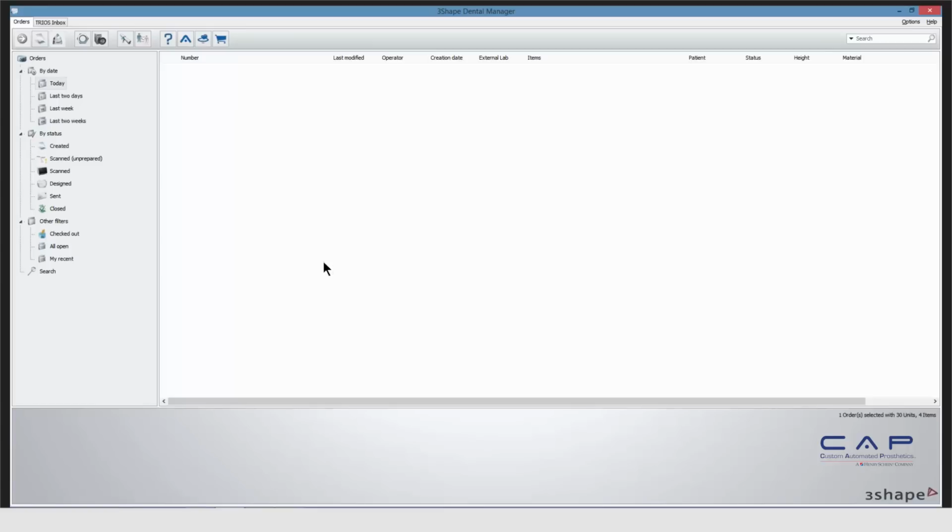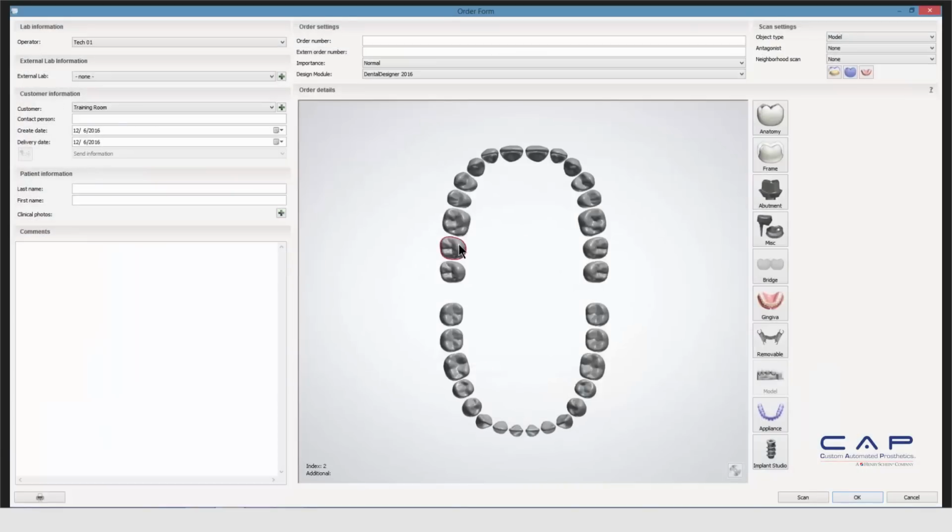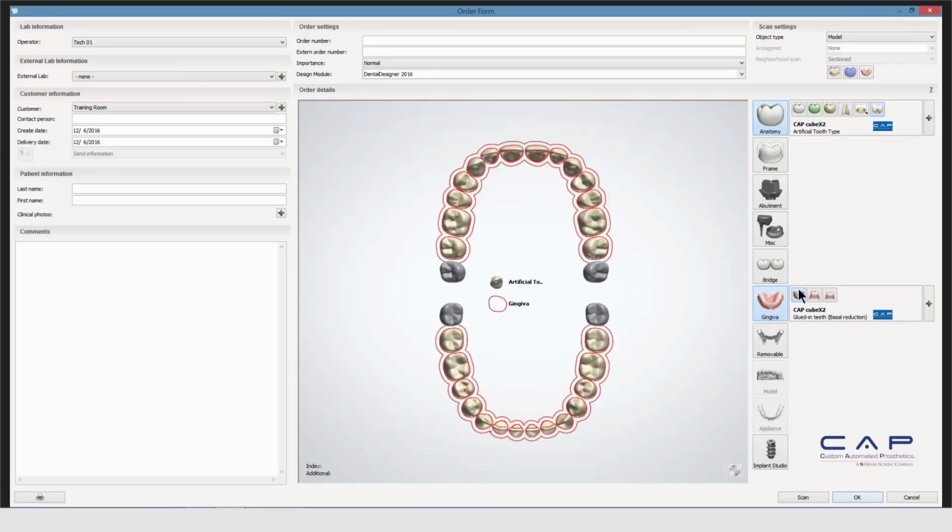So first we're going to go ahead and set up the case just by opening up a new case in 3Shape and selecting the teeth that we want to do. For this case, it's going to be a full upper and lower, so I'm going to choose all the teeth on the upper and lower arches. Okay, and then we're going to go to Anatomy, and we're going to choose the denture teeth, which is the last option on there. And then we're going to go under Gingiva and just select it, and it's going to automatically select that denture scan for us. Okay, I'm going to go ahead and name this real quick. And we'll get on to scanning.